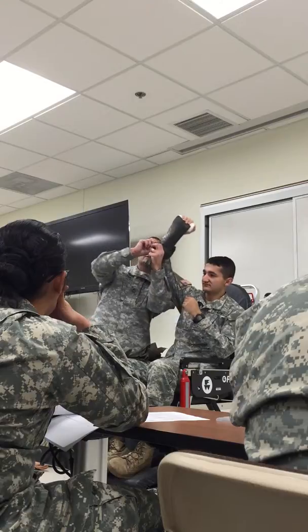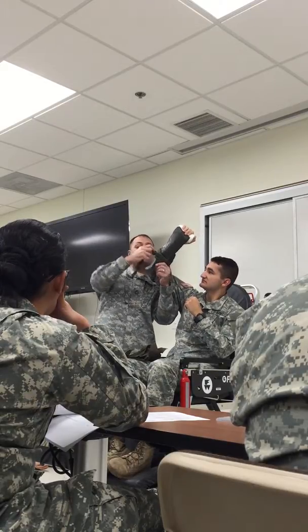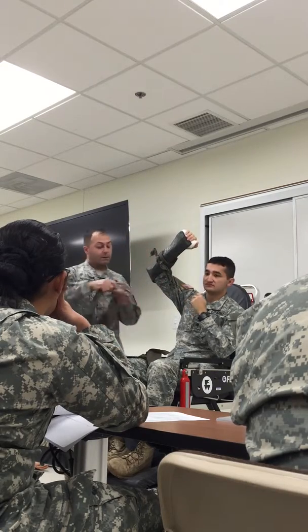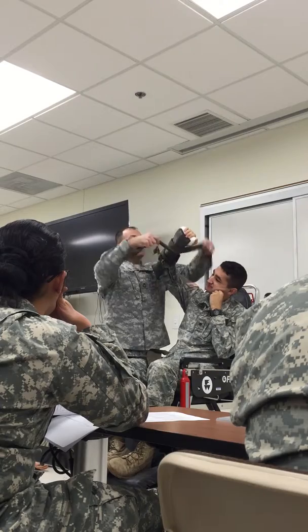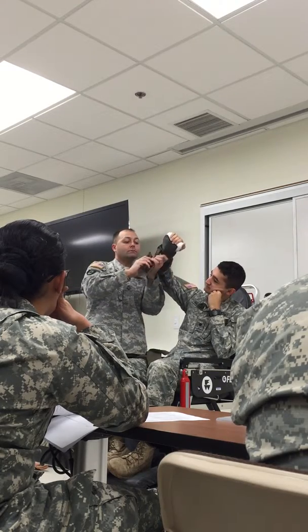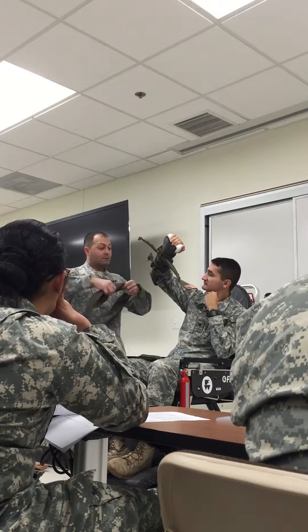Can you just hold it on like this? Right over left. Don't cinch it down either. Remember, he has a fracture. It needs to be somewhat loose, but left over right. That makes sense. Above and below again. So would we tell the patient to hold their arm up? No, I'm just doing this so you can see the knots. All right.